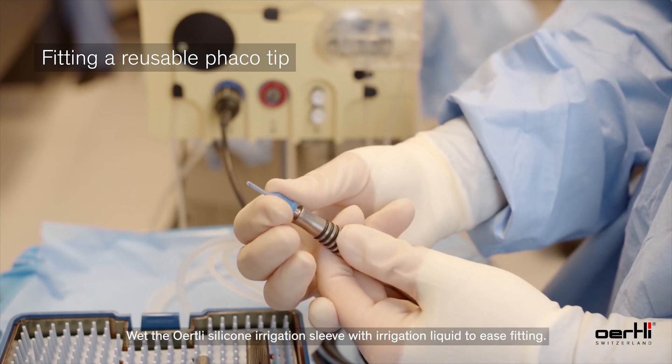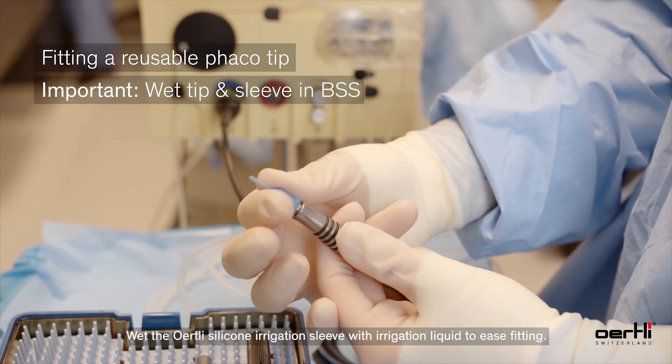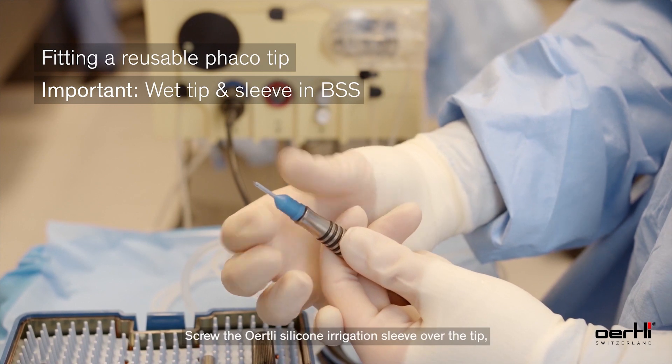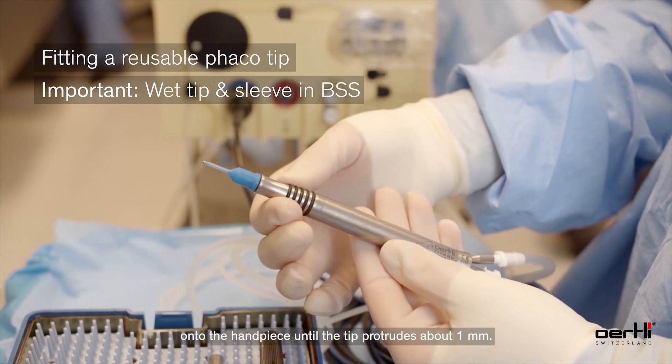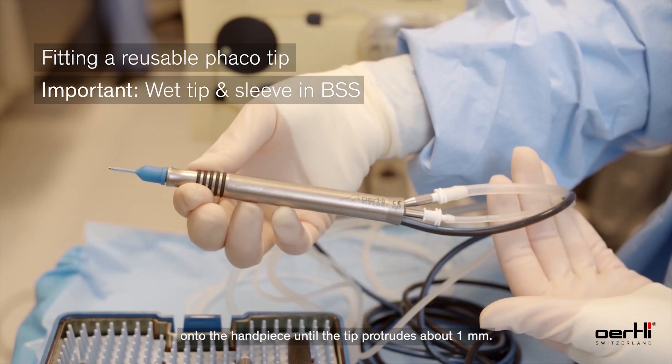Wet the silicone irrigation sleeve with irrigation liquid to ease fitting. Screw the silicone irrigation sleeve over the tip onto the handpiece until the tip protrudes about one millimeter.